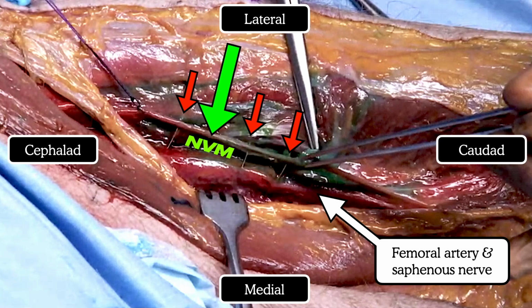Well, we did a cadaver study recently that looked at this. We put needles in old school style, right? Look for the artery, advance a needle to the artery, and then put wires through the needles and take the needles out. When we opened the cadavers up, over 50% of the time, the wires were either touching the nerve to vastus medialis or in fact passing right through the nerve. So again, nerve stimulation can help identify those nerves before you cause harm.